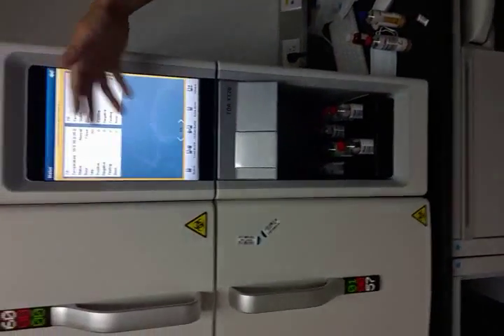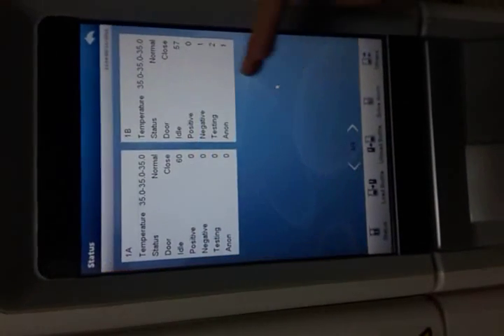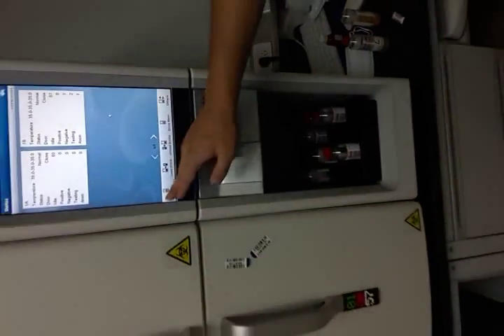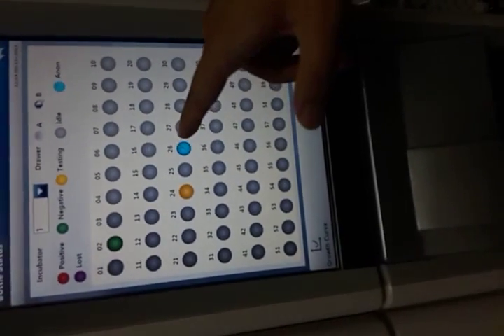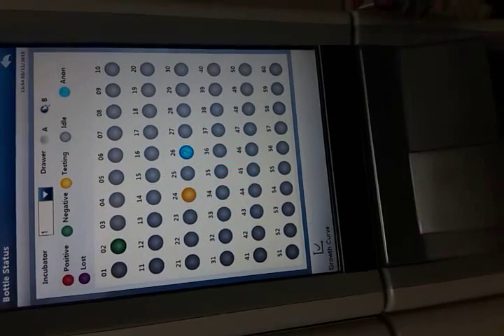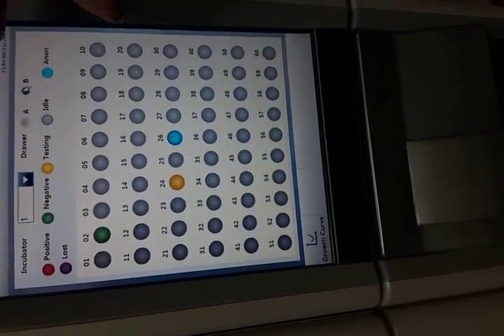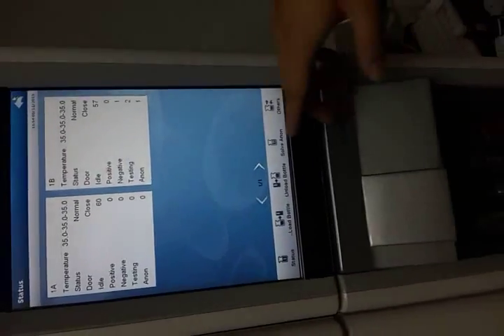so we know this is the wrong reaction, and you can see and hear one beep from the instrument. If we directly insert one bottle into the blood culture instrument without scanning the barcode, we're going to find that one anomalous blood culture bottle is detected by the machine. If this situation happens, we should solve this anomalous blood culture bottle. So we should follow these procedures.